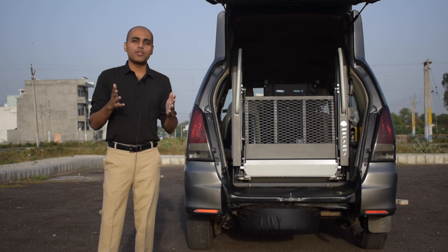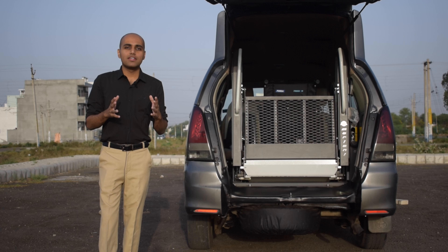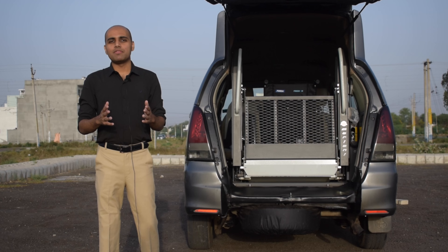Through this video, I will try to demonstrate the explicit working and use of these lifts, which all fits within this beautifully done fabrication work. So without wasting any more time, let's dive in.